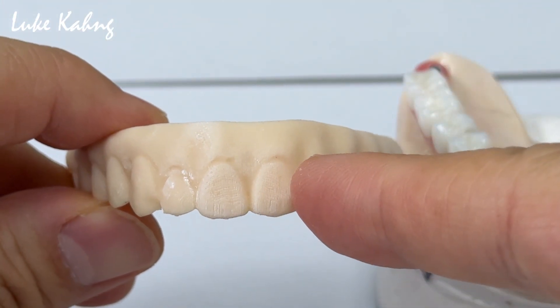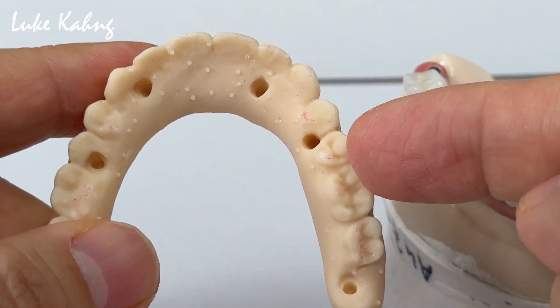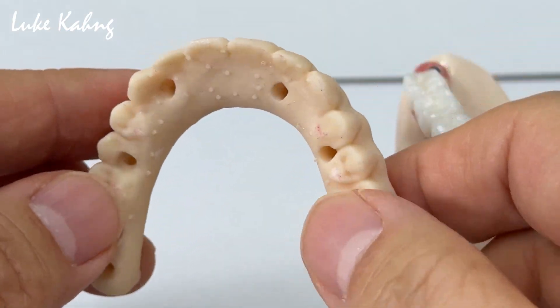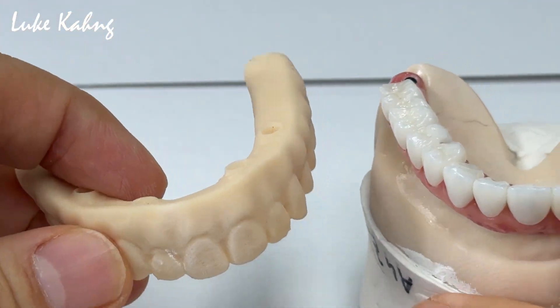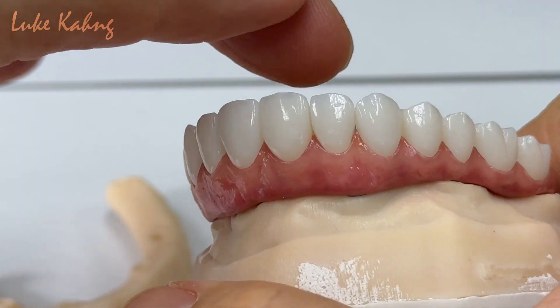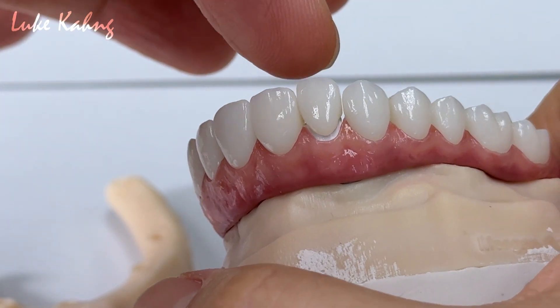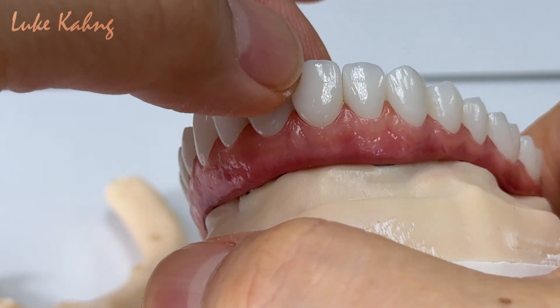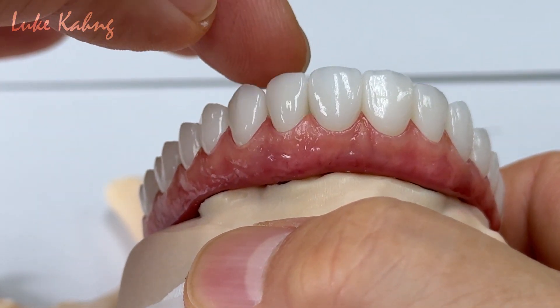This one is a high-grip acrylic. These patients wear hybrid acrylics. The problem is they keep popping out. Because of the acrylics from another laboratory. Now we made the Cytun 7 Star — just like a diamond — like tissue adaptation, great emergence profile. We don't need any composite; we just need a cement on top of this. We are going to try it in the patient's mouth after cement.